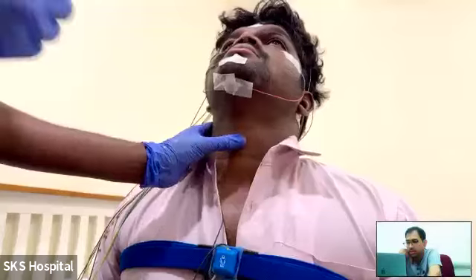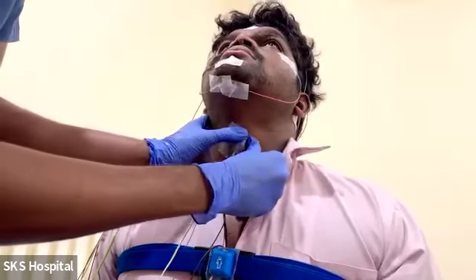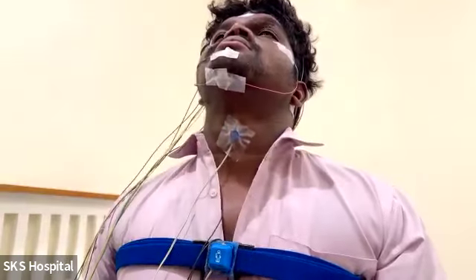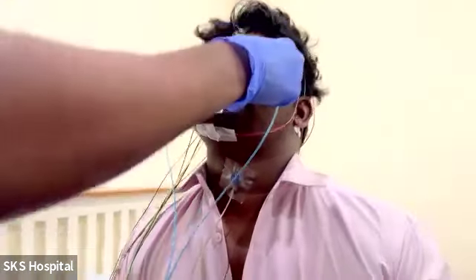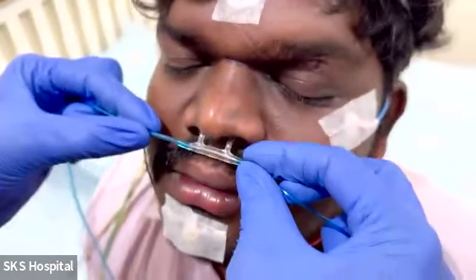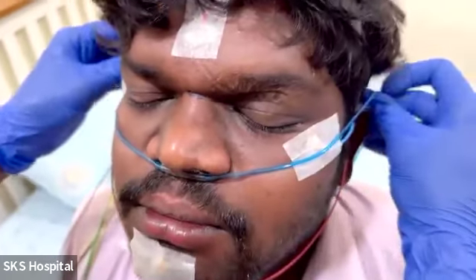So that is the snore sensor. The thyroid cartilage is being palpated, and then on either side of the thyroid cartilage, the snore sensor is being put. It's just a simple microphone which picks up snore sounds. And that is the nasal cannula, which picks up nasal pressure transducer signals. Just like as we connect a nasal cannula in wards, it's being connected.